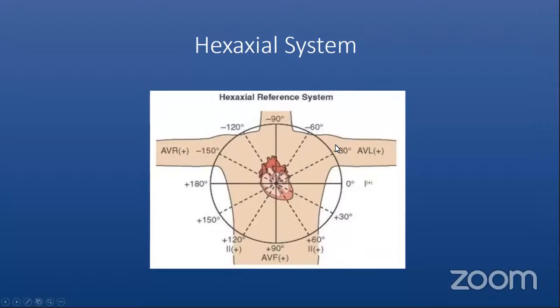So between the bipolar leads, lead 1, lead 2 and lead 3, there is about a 60 degree angle between them, and each limb lead has got a 30 degree angle. So basically in this system, as I said, lead 1 and AVF cross at a right angle at the electrical center. And the bipolar leads, lead 1 and 2, are clockwise with a 60 degree angle between them.